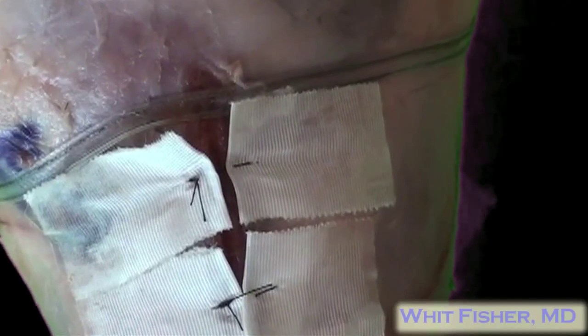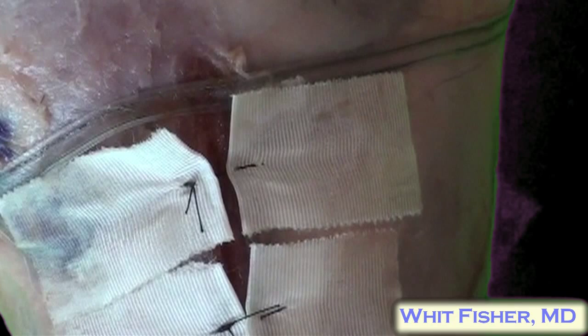That doesn't hurt at all! You just repeat the process for however many tabs you have along the side of your wound and tie those knots nice and tight. No needle ever touches the patient.